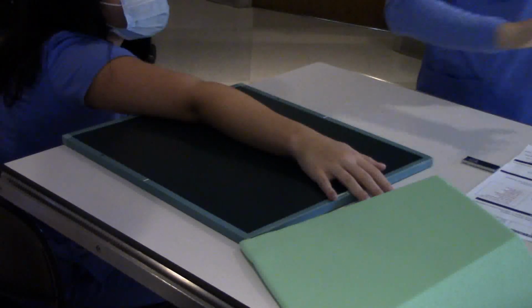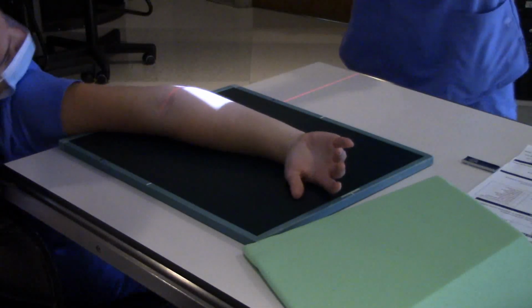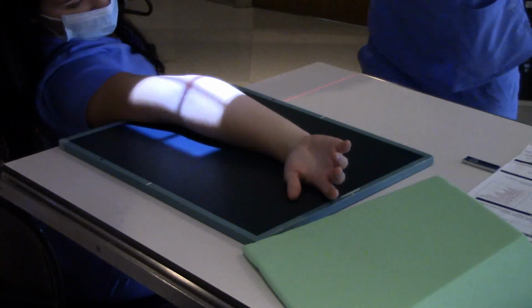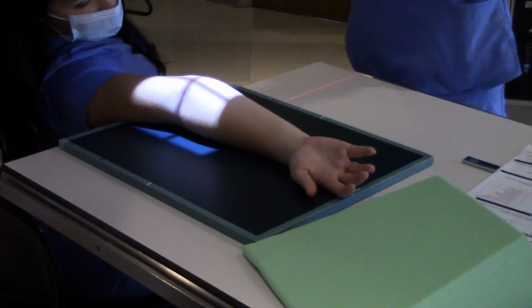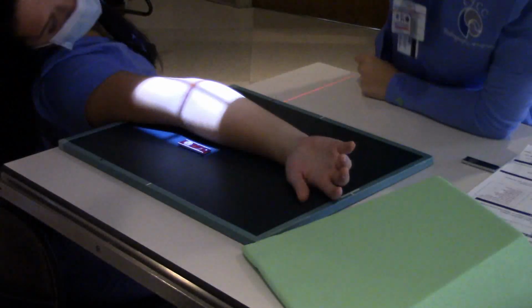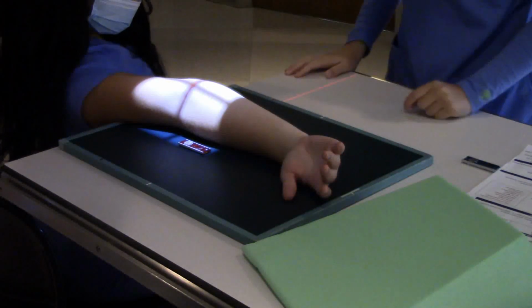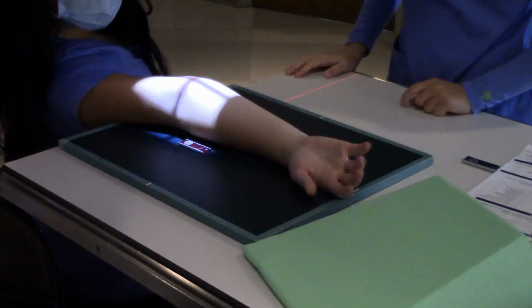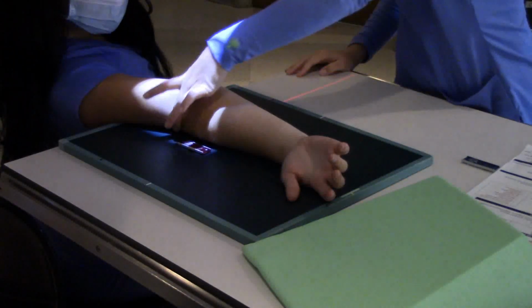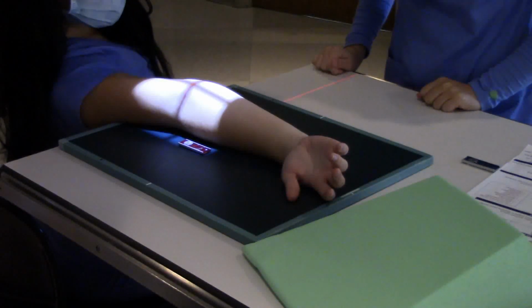Okay, and then external oblique is, there you go. That's actually really good. Some patients can do this and some patients can't. Why does my arm look crooked? Because you got it in an external rotation. Doesn't it look weird? Yes, it does. But everybody's arm looks like that when it's rolled way external.